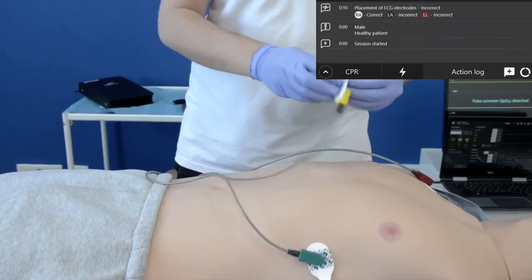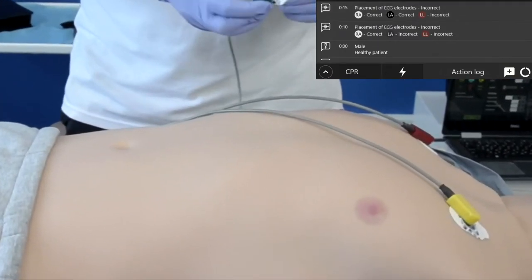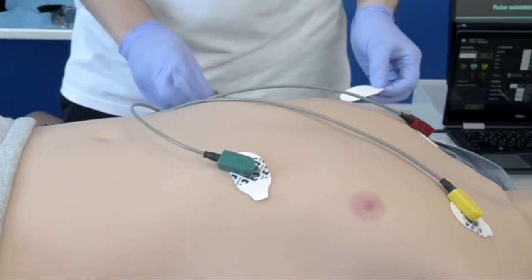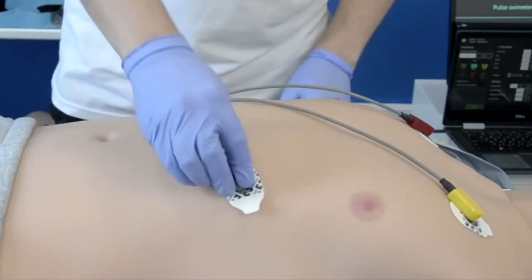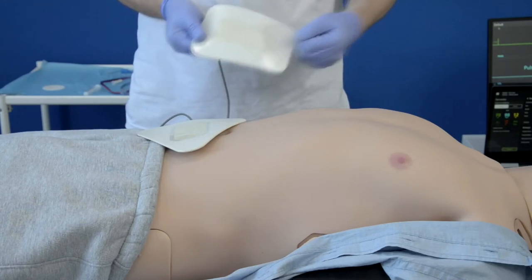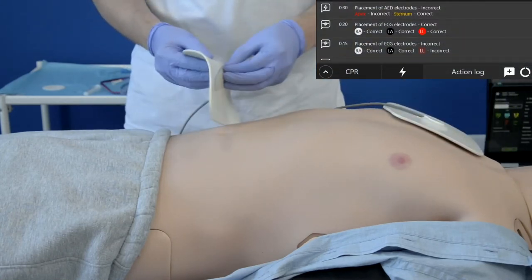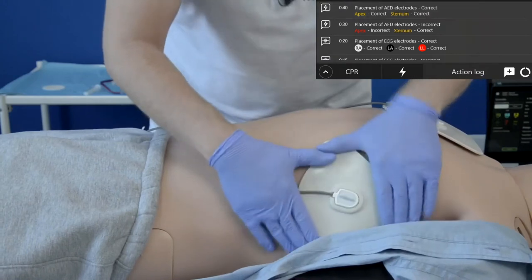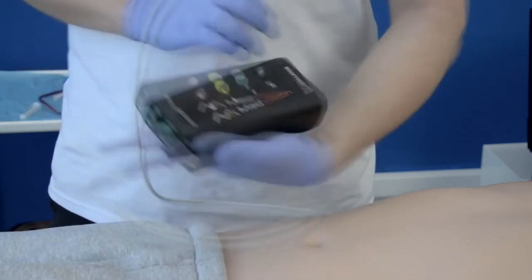You can use real ECG stickers with Leonardo — just stick them on the skin. We've even tested leaving stickers on for two weeks and they left no visible marks after removal. Under Leo's skin there are sensors for correct electrode placement, which will show in the action log. SpO2 monitoring is supported with a real pulse oximeter and there is a special port on our adapter for it.